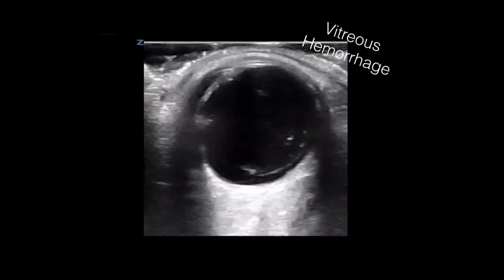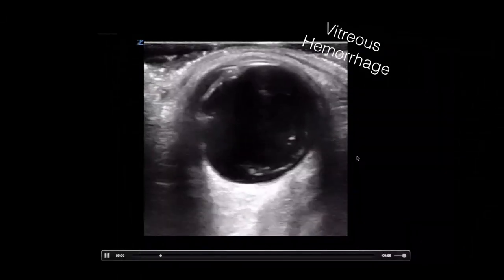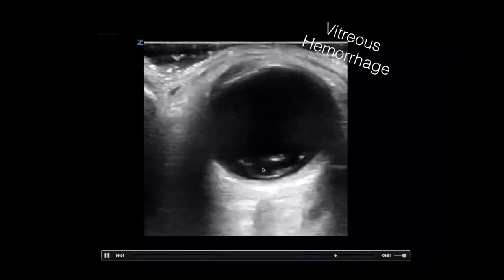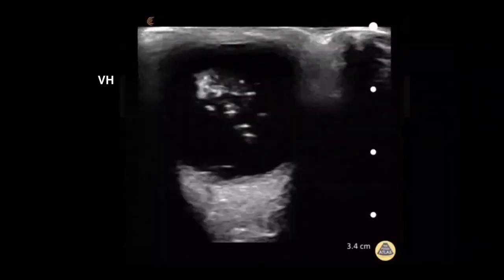So here's another example of it. This is probably one that's been going on a little bit longer or is just a little bit larger. You can see the blood is a little bit more congealed in the posterior part of the eye, and as the eye turns, you still get some sloshing there, some of that after movement. And this is again a sign of a vitreous hemorrhage. And here's just one more example for you.